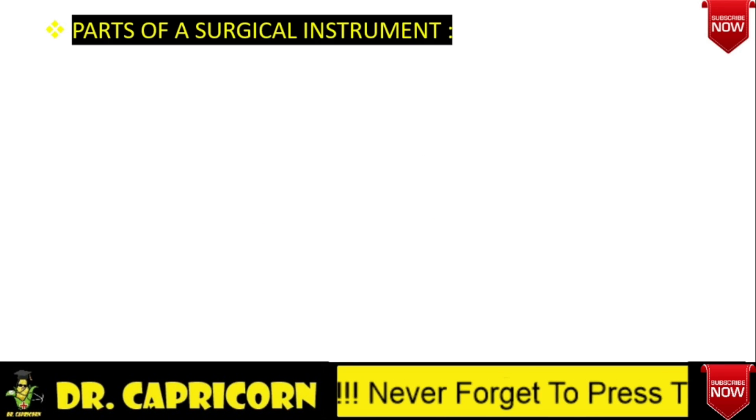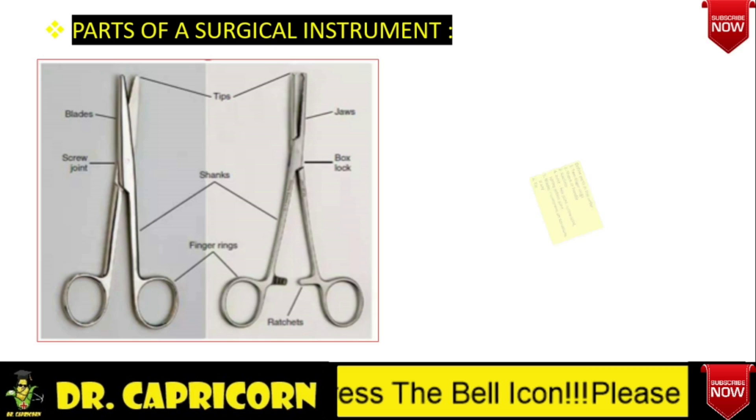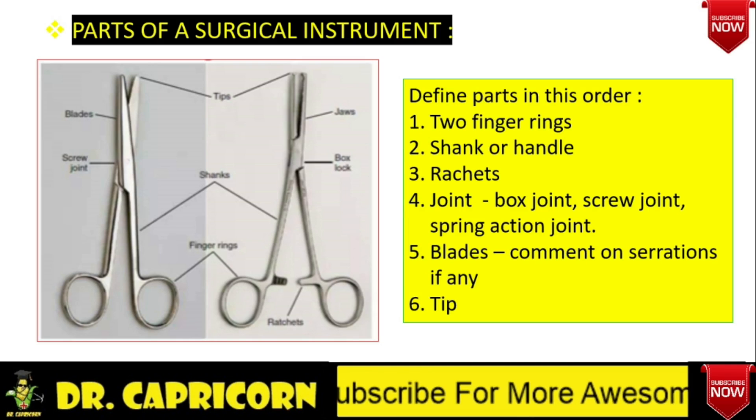Whenever you get the instrument in the exam, how will you define and describe the parts of the instrument? First, there are two finger rings, then there is a handle, also called as shank, which can be small, medium, or large. On the handle, there may be ratchets or it may be without ratchets — ratchets are used to hold any structure firmly. Then there is a joint, which can be of three types: box joint, screw joint, and spring action joint.